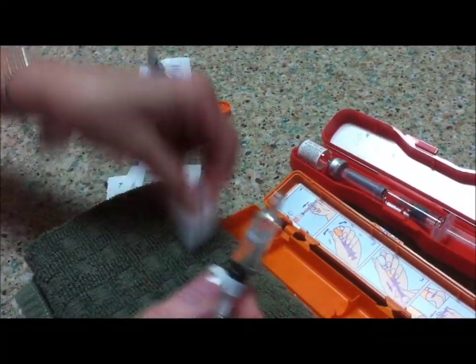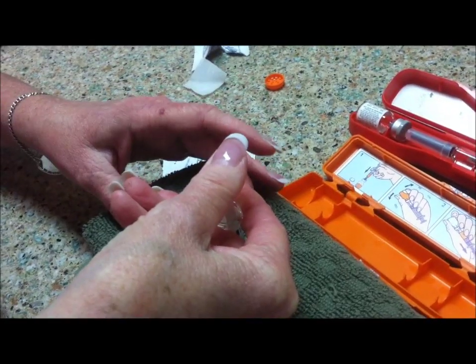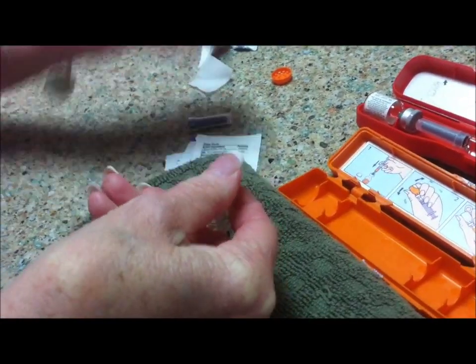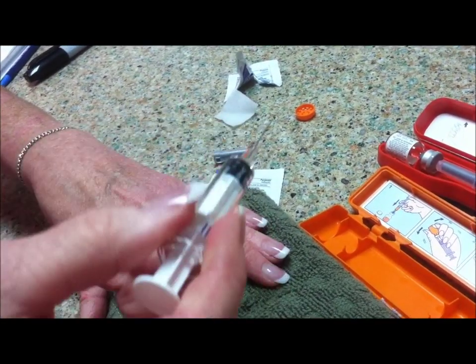This is going to be my pretend patient. We would wipe the site, go straight in, and administer the medicine, and hold it for a few seconds so it doesn't leak out. Then you want to dispose of this in your sharps container.